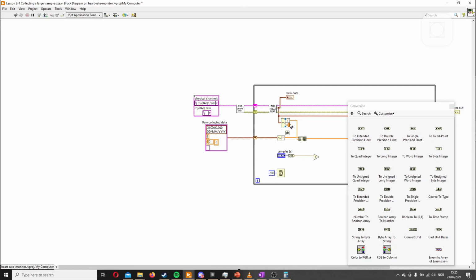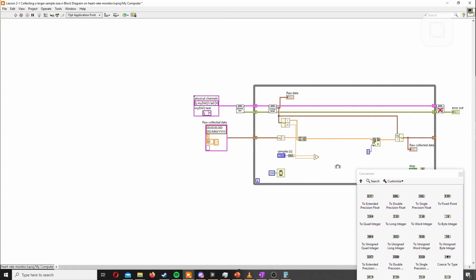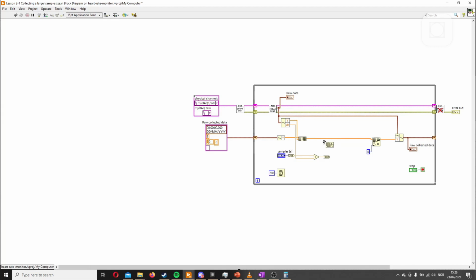So I'll just say this becomes a double, this goes in here, we can move this there, and then we want it back to an I32 again. And then we'll convert it back into I32, and then that's the amount we need to subtract from the front of the array. So what we need to do then is to figure out how many elements is in the array by doing this, and then subtracting this amount from this. And then there you go. Now we will figure out how many we have, and subtract that, so everything over that amount will be deleted.